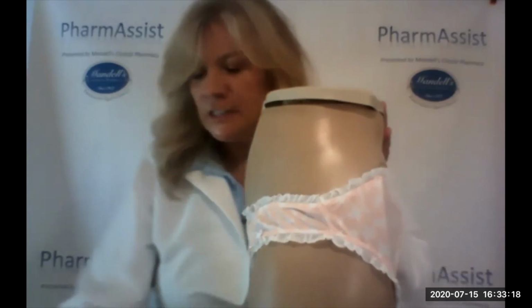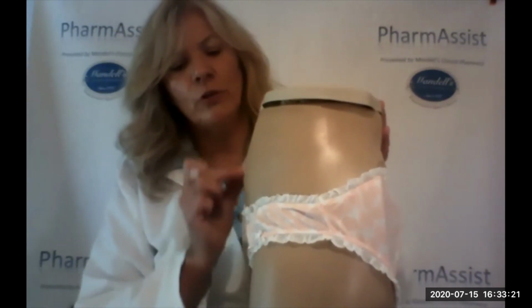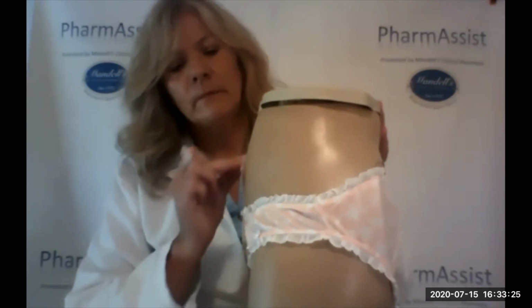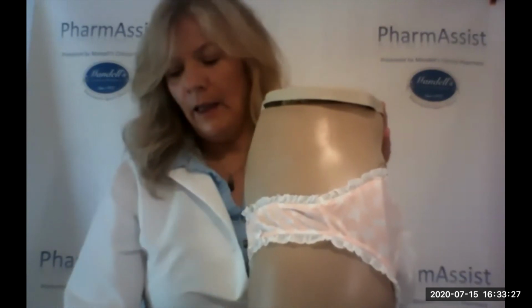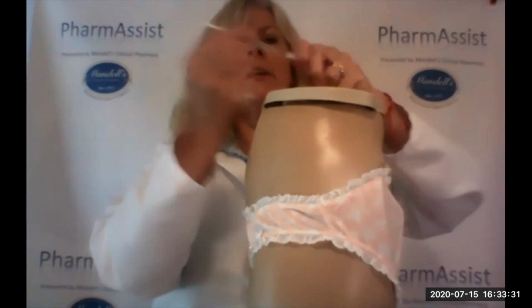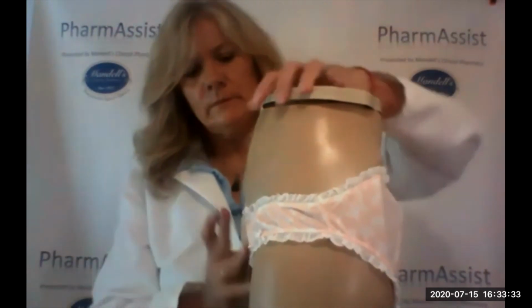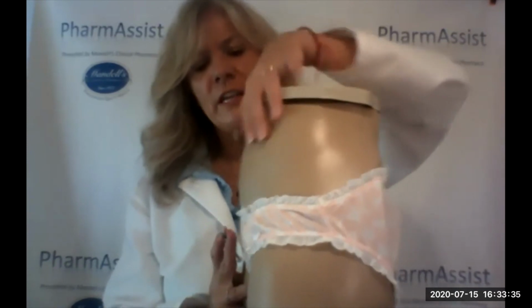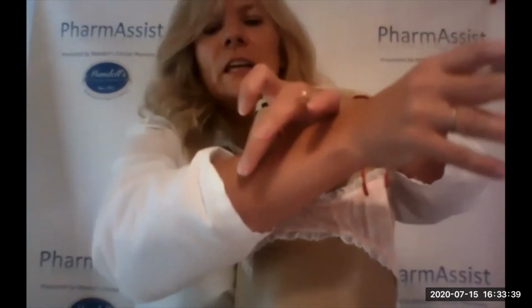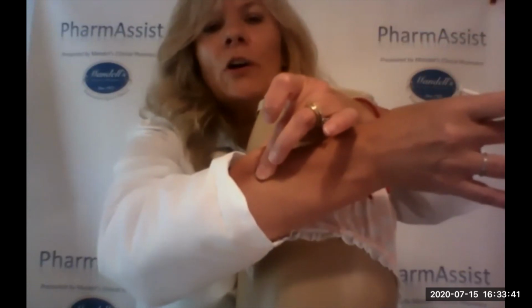So one of the things that you'll want to do is make sure that you clean the area with alcohol. And one of the next steps we do is we uncap the needle. We give a little pinch to the skin. So what I'll show with my arm is that when you're pinching the skin, you just don't want to pinch too hard and squeeze too hard.